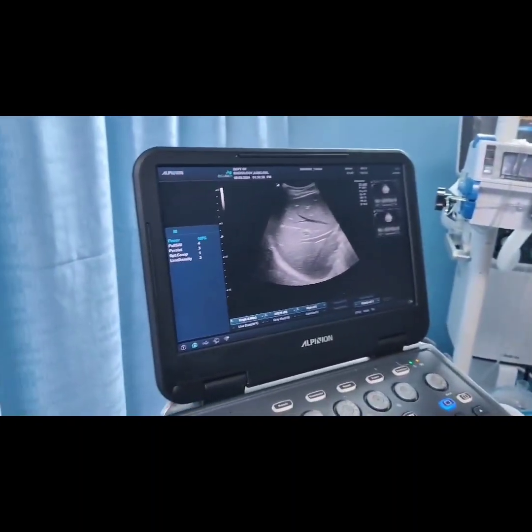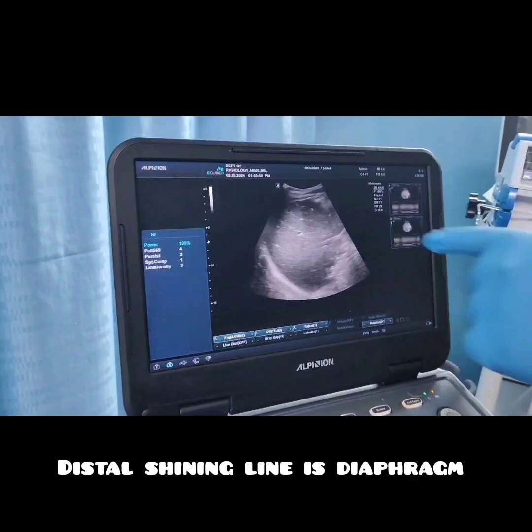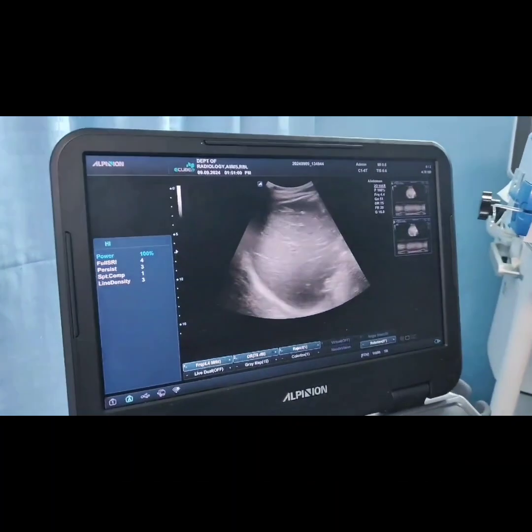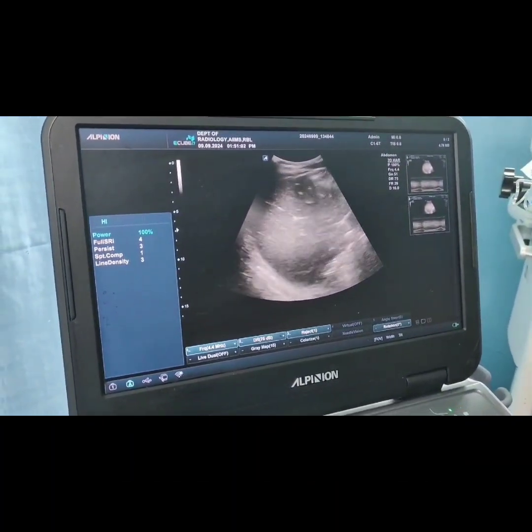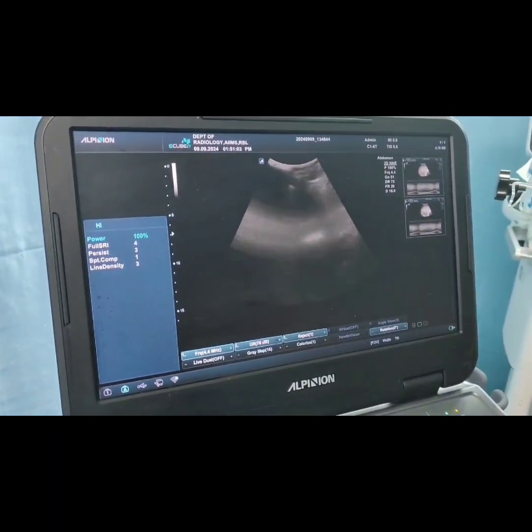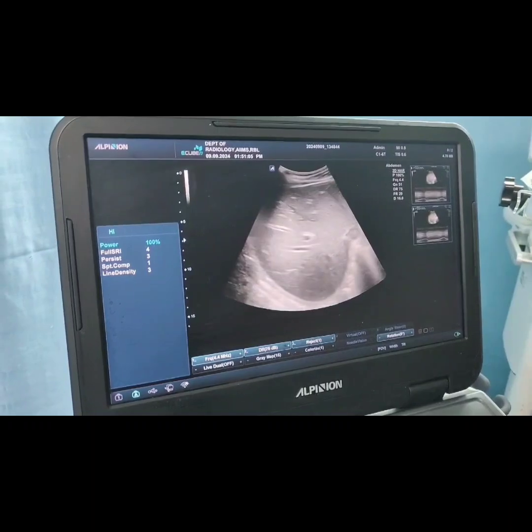As we can see, there is a liver shadow, and distal to the liver shadow there is a shining line covering the liver, which is the diaphragm. So here both the liver and the diaphragm are visible.